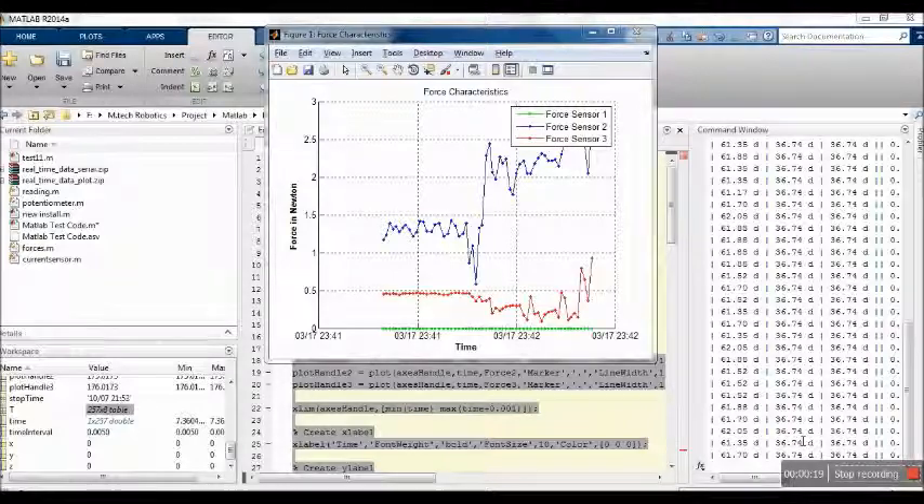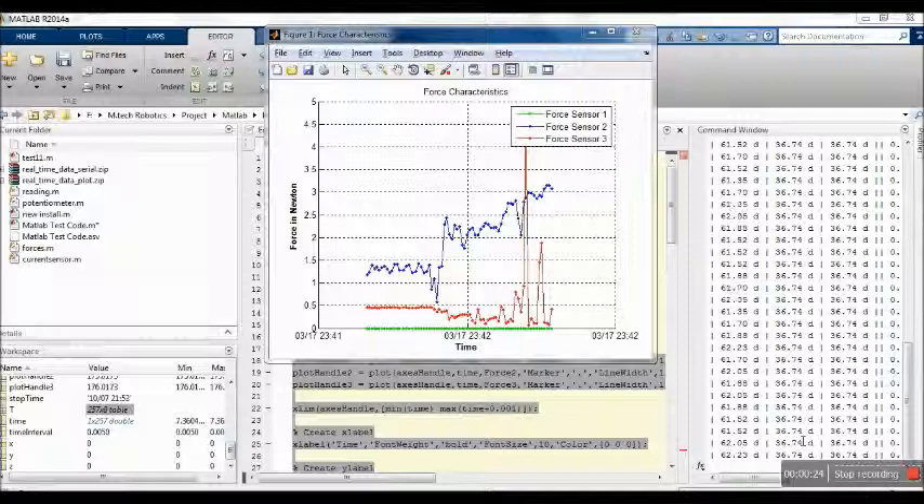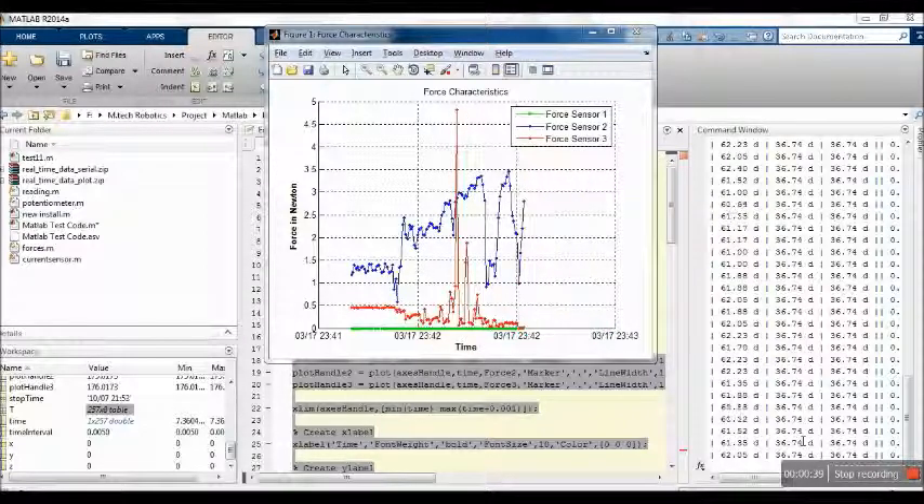In this project, angle sensors to measure rotation of the arm segments and a force sensor to measure the force acting on the exoskeleton are integrated to develop a real-time simulation of the device. Force plotting and real-time monitoring of the device can help in measuring and predicting the recovery process.